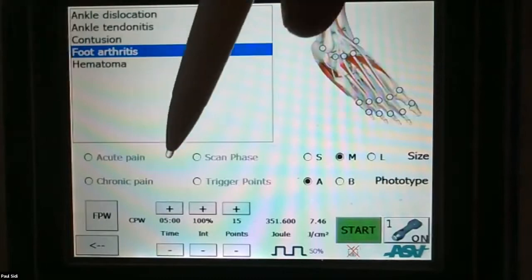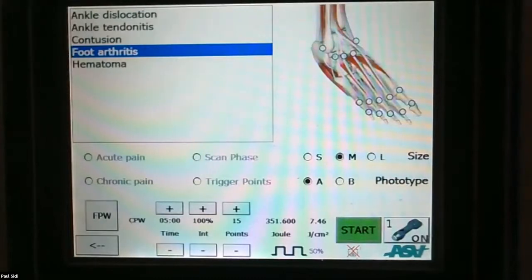So we can see foot arthritis. It's literally 5 minutes. Plus I did my scan, which is 4 minutes. That's 9 minutes of treatment, and I'm giving them a treatment which they will find unbelievable. You can do these things so quickly on a midfoot arthritis, which is really crippling them because they are not able to walk. Make sure you get them the right rocker shoes or something with a good arch. Make sure they're probably taking some anti-inflammatories. Use a bit of ice on there, but give them the laser, and this will just change things forever. And they'll start telling everybody how great you are.